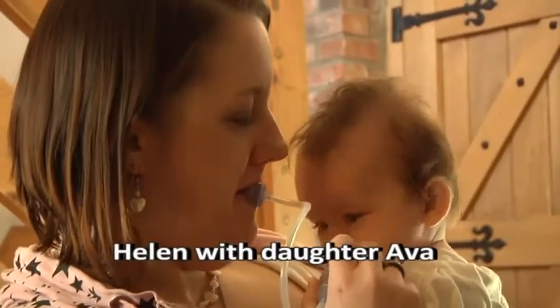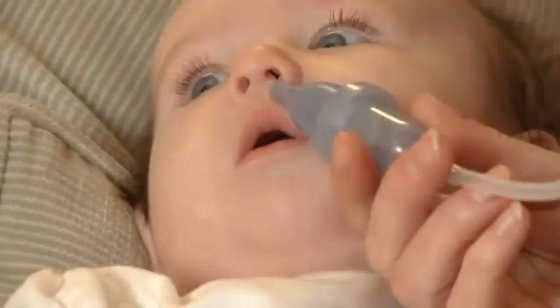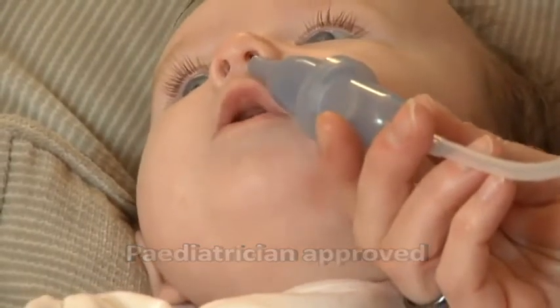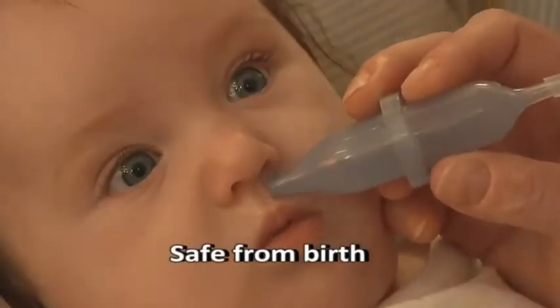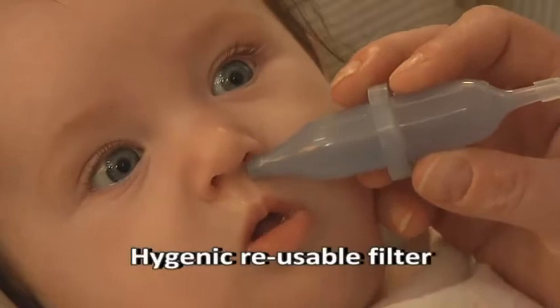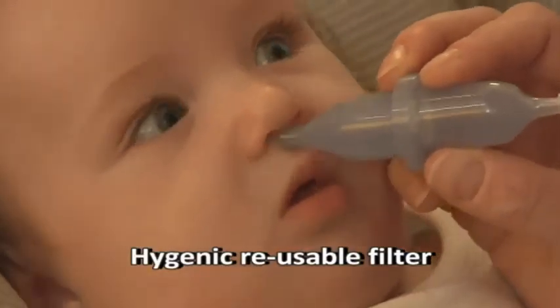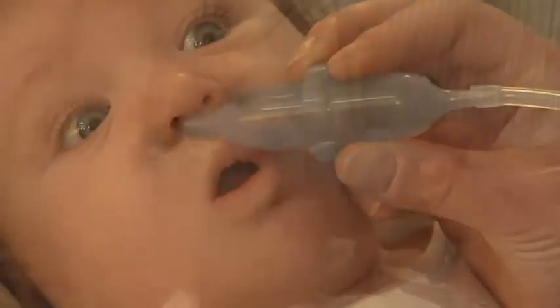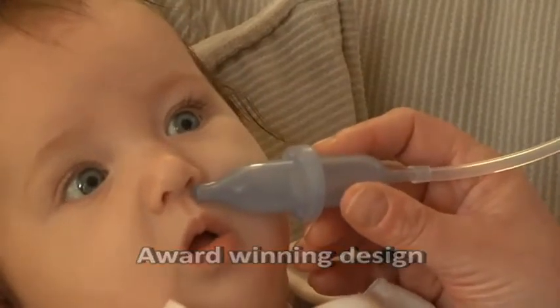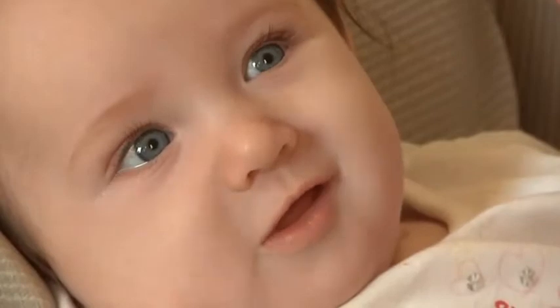Put the mouthpiece in your mouth and hold, then put the bulb end at the baby's nostril and target visible mucus. You can do this one-handed so the other hand is free to secure and comfort your baby. Simply suck and the congestion will collect in the sealed chamber behind the filter. The suction can be controlled and you can look through the chamber to see what is happening.